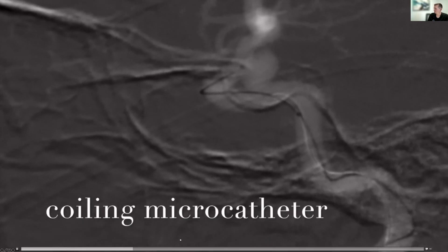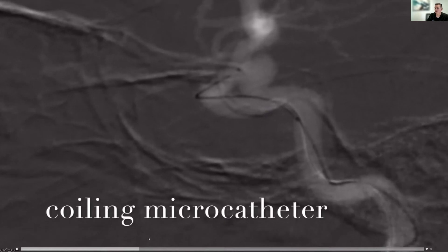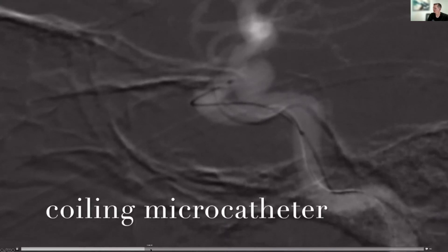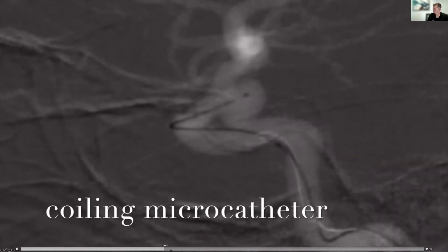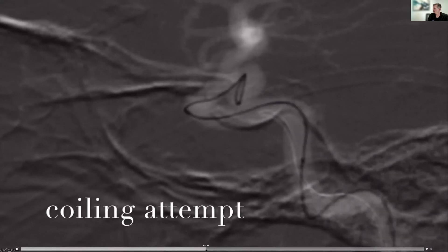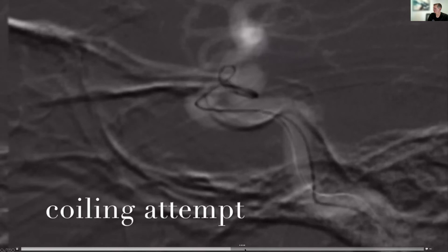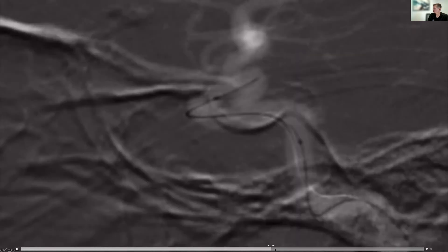It's a simple coiling. Coiling is becoming a lost art. It's very easy to do some of the newer techniques with flow diversion and stenting, but this is still a very good technique. You'll see here that we're able to get really good placement of our catheter, stable position — and that's really going to open the door to create a stable coil construct, with a little bit of maneuvering.